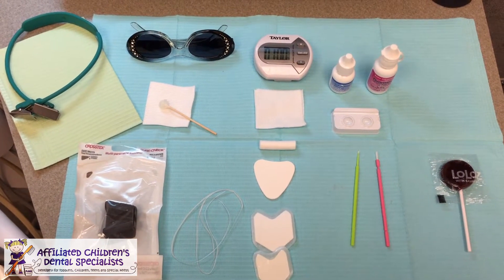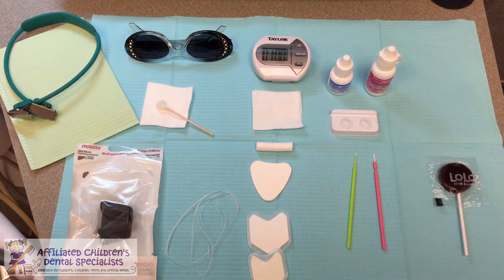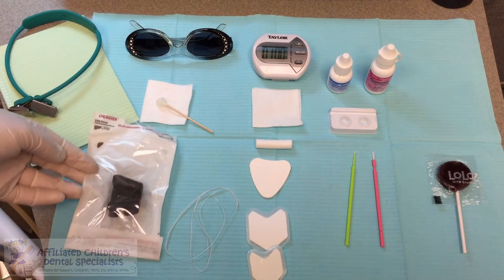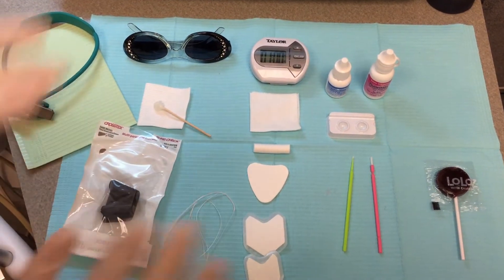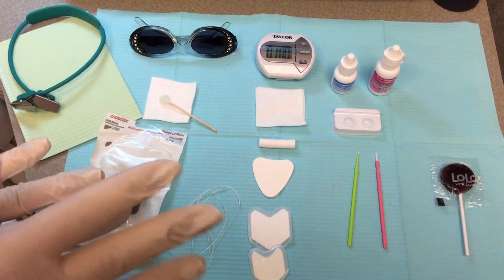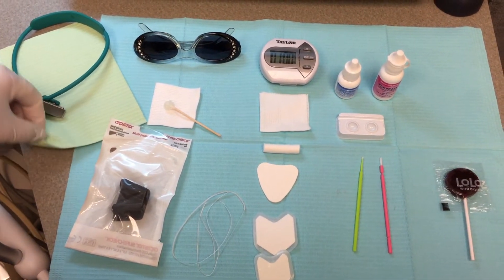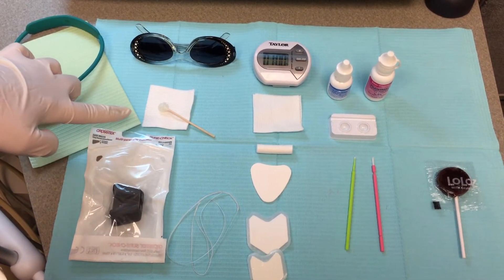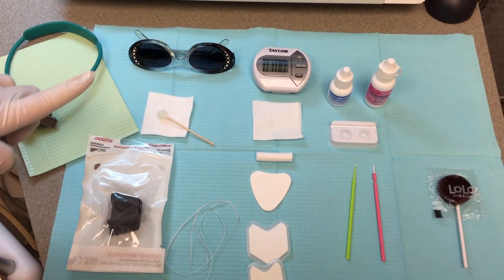We're going to show you our basic setup for applying silver diamine fluoride. First, you want to make sure you protect the surface you're working on — I like to use a plastic-lined patient napkin. Make sure you're wearing gloves when handling any materials. Protect your patient with a plastic-lined bib, sunglasses, and copious amounts of Vaseline over their lips and skin to prevent a little temporary tattoo.